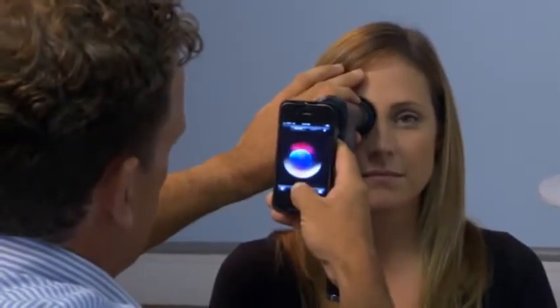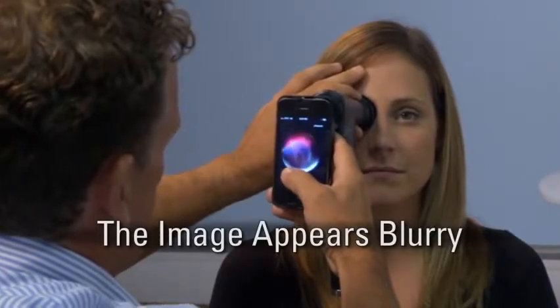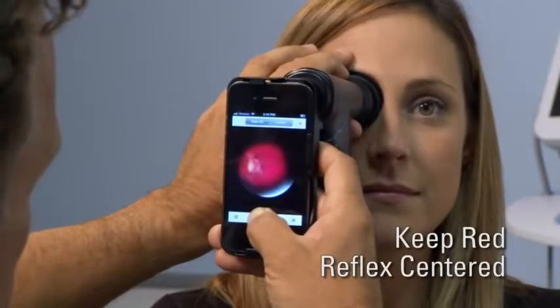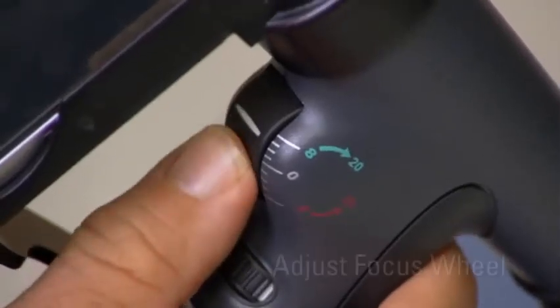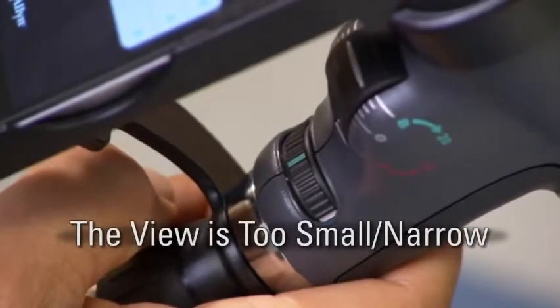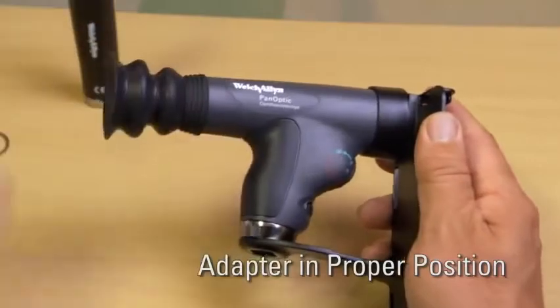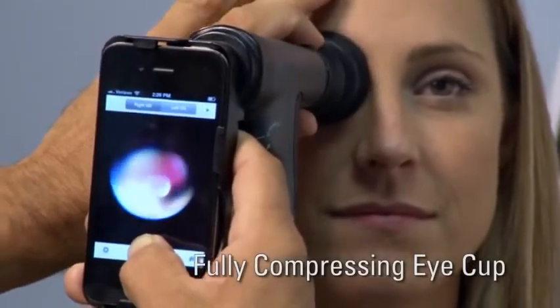The iPhone camera should do all the focusing for you, but if your image is not in focus, try the following. Check to see that the focus wheel is set at 0. Make sure you are keeping the red reflex centered on the screen, otherwise it may be focusing on a different part of the eye. If the image is still blurry, adjust the focus wheel to compensate for refractive error. If the view seems too small or narrow, make sure you have the large aperture selected. Be sure the iExaminer adapter is pushed into proper position on the PanOptic and that you are fully compressing the eye cup over the patient's eye.